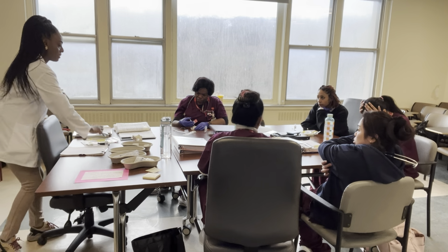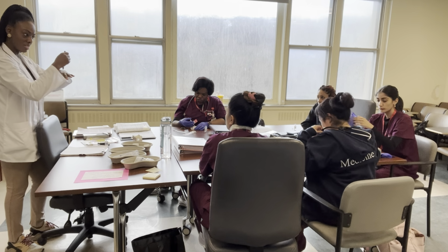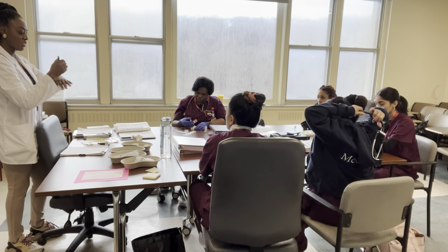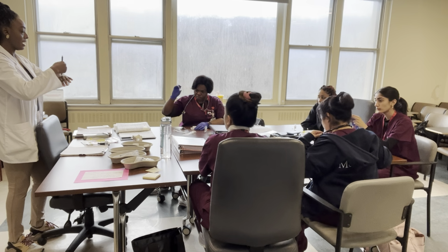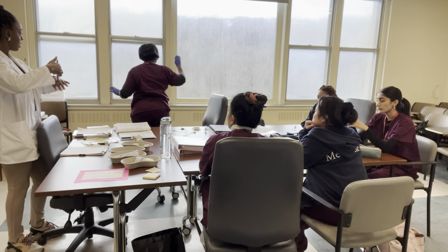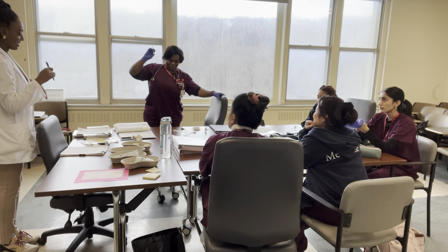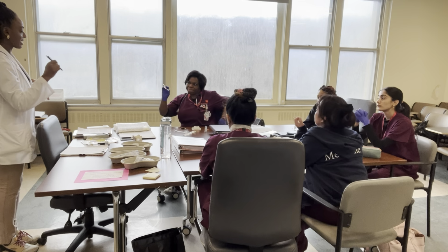Because if you let go of the needle, imagine I'm into the patient's hand and I let go of the needle. Is it going to stay? That's why you still have to stabilize it. So you go in, and you're still holding it between your 2 fingers. Your needle next, come back, sit down. Take it out one more time.